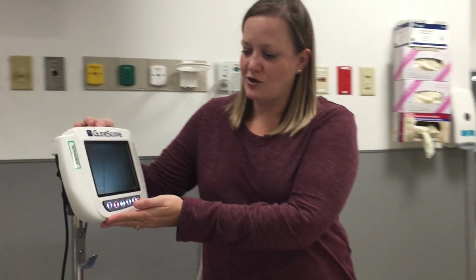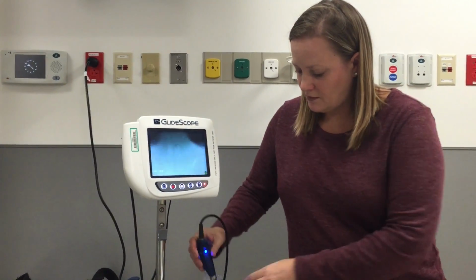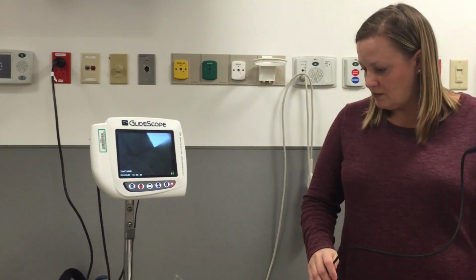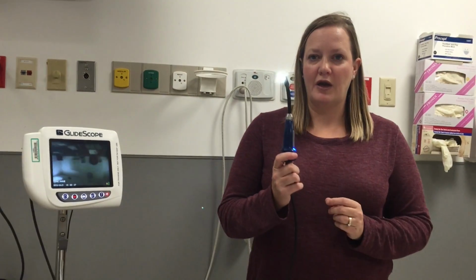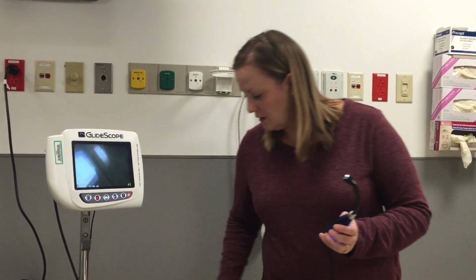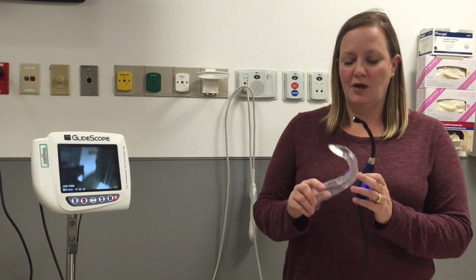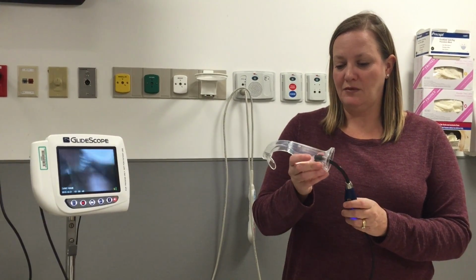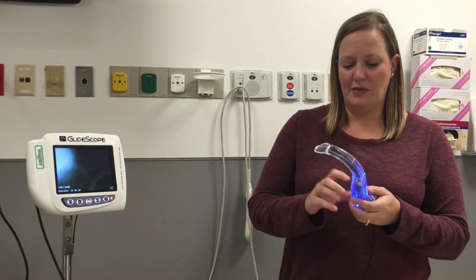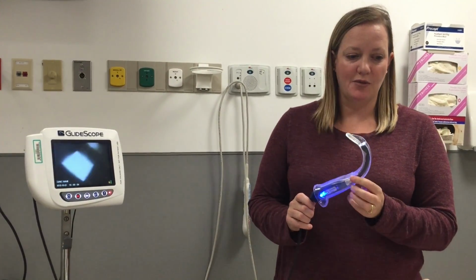And you will see that your glide scope has a screen and the power button is here. This is your camera, and this is going to help you see inside the airway. You will place a disposable plastic mechanism over the glide scope before you place the glide scope into the patient's mouth.